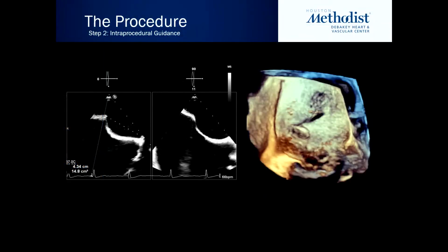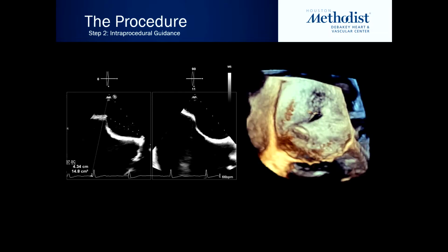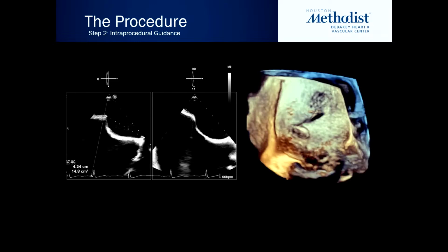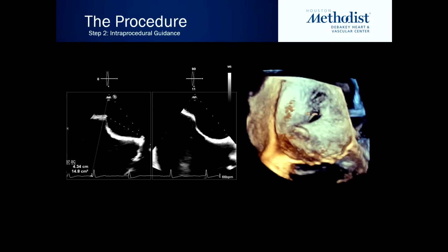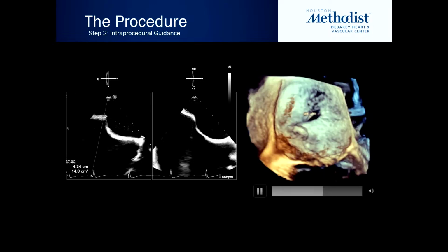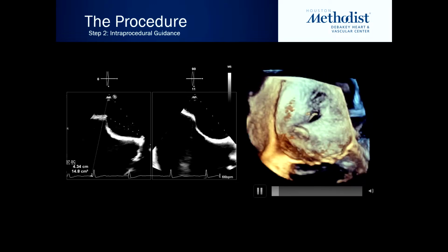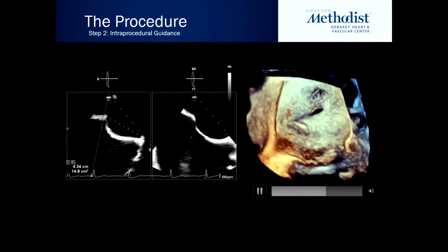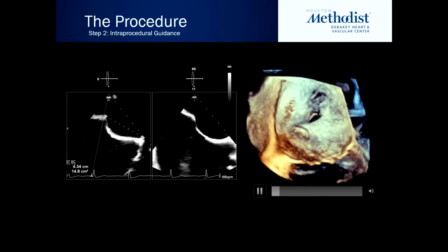So after we find the ideal spot, we also wanted to check making sure the height is acceptable, above 4 centimeters, where we find that's an ideal spot for MTR procedure, where you can have enough height to maneuver the catheter itself. So we measured this, and then we felt that that's acceptable, and we also reconstructed with a 3D structure. Over here on the right side, where the dropout is where the fossa is. How we made it happen is that we actually decreased the gain, so you're able to see the fossa. And over here, we can directly see how they puncture and cross the interatrial septum.